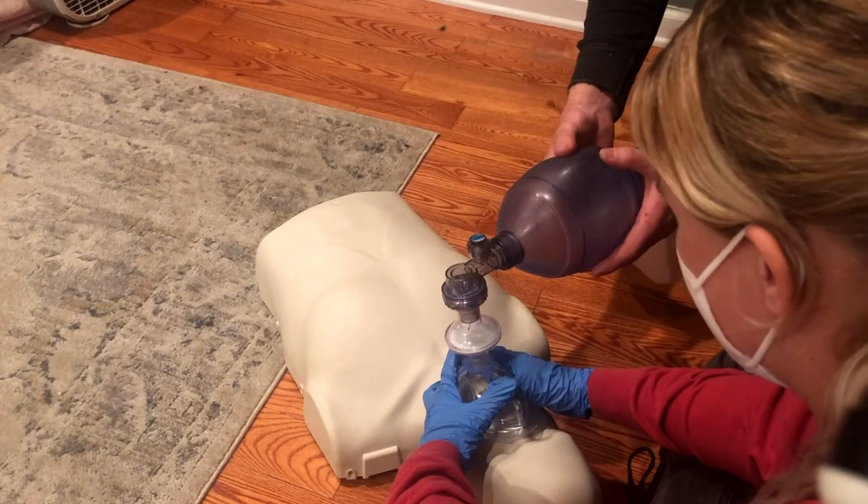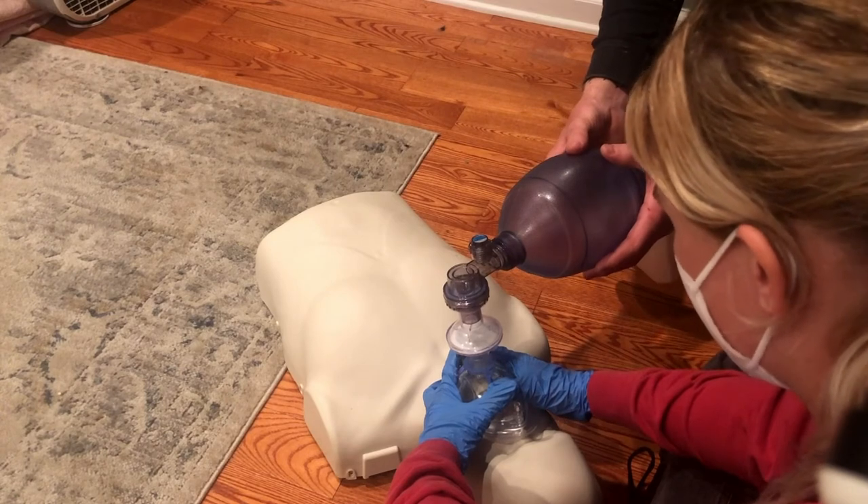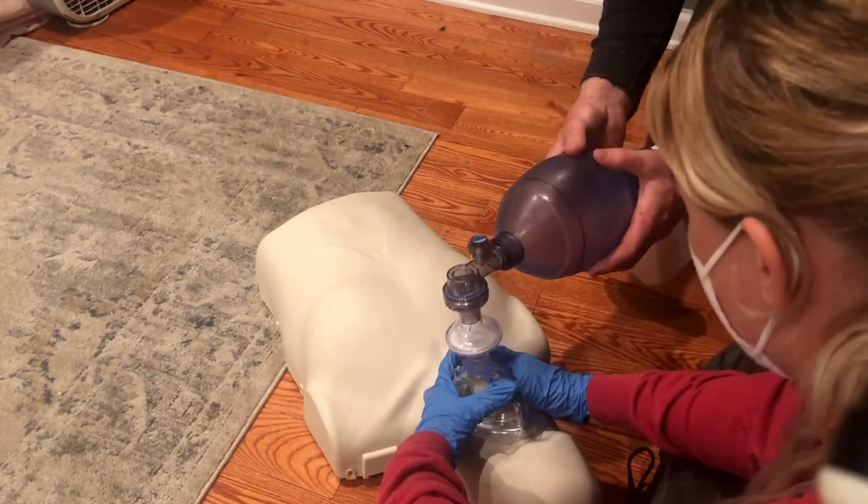Give 10 to 12 breaths per minute. Count the breaths out loud as you squeeze the bag — ideally, both responders should count out loud. Look for signs of breathing between bag squeezes.